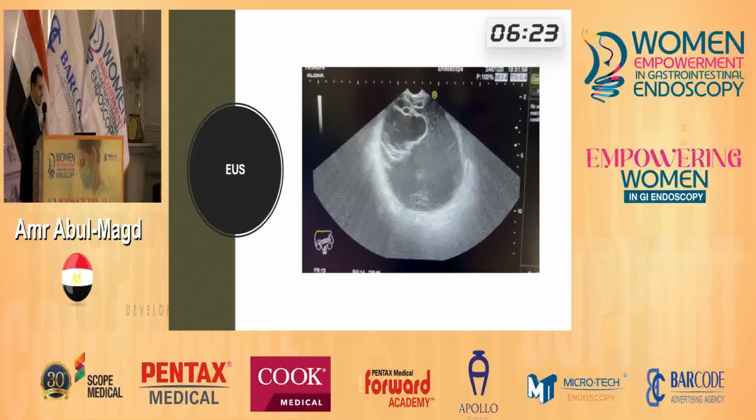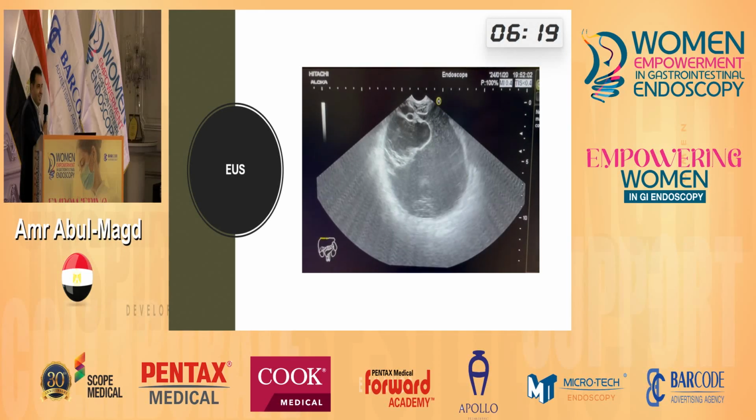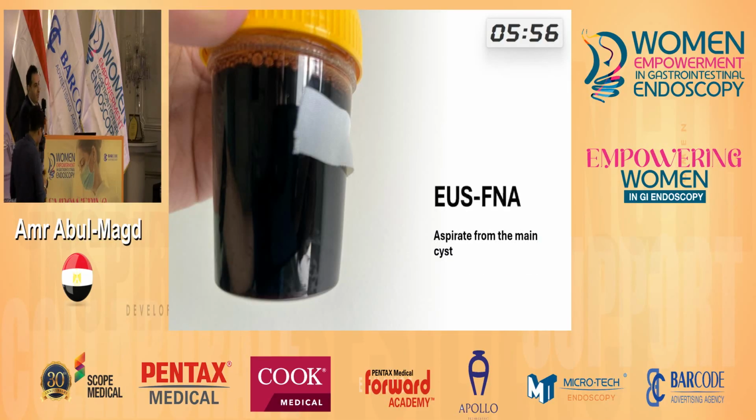Dr. Amr Al-Fuli, do it or not? You mean for draining? Drainage. No. This septation is not typical for drainage of a pseudopancreatic cyst. The wall is thickened. There are internal echogenic structures. In my opinion, it's not completely right. So I started to insert my needle, and this is what I found.